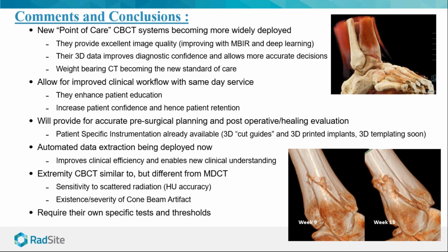In the future, these types of images are going to provide pre-surgical planning and post-operative evaluation and healing evaluation. The image down in the bottom right there is the same patient 6 weeks apart, showing the healing of an ankle fracture. Patient-specific instrumentation is already available with 3D, what are called cut guides and 3D printed implants, and 3D templating is only a matter of time before it is introduced.